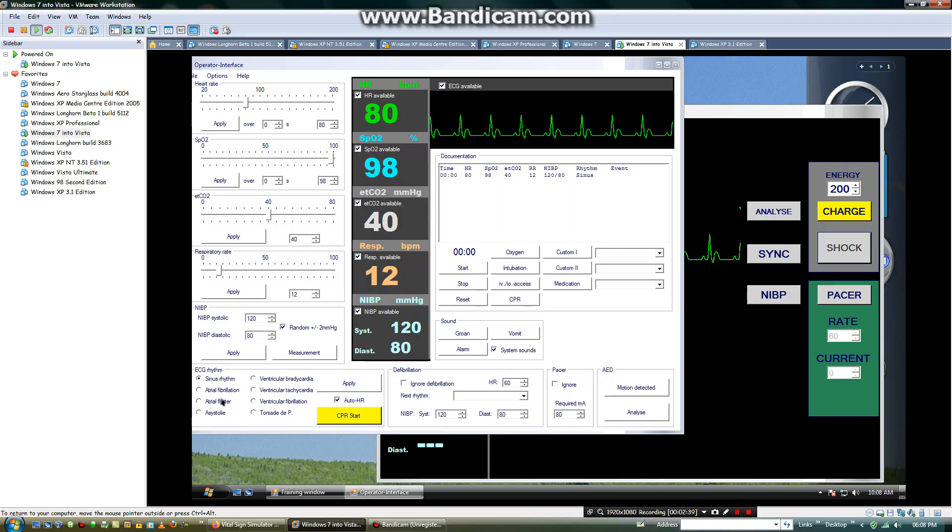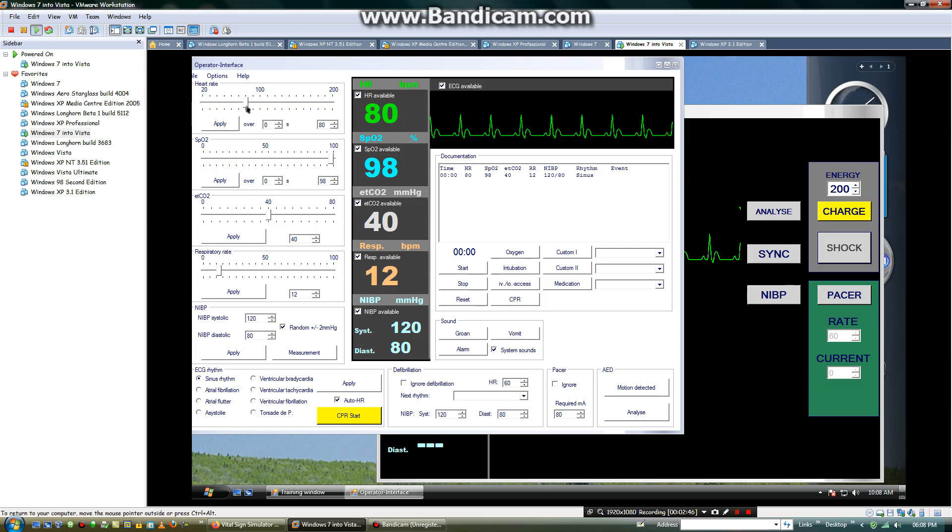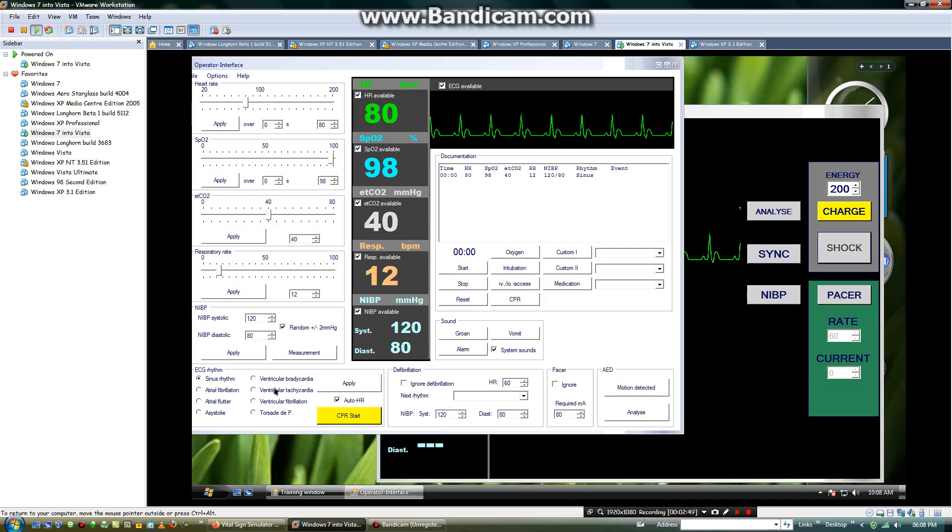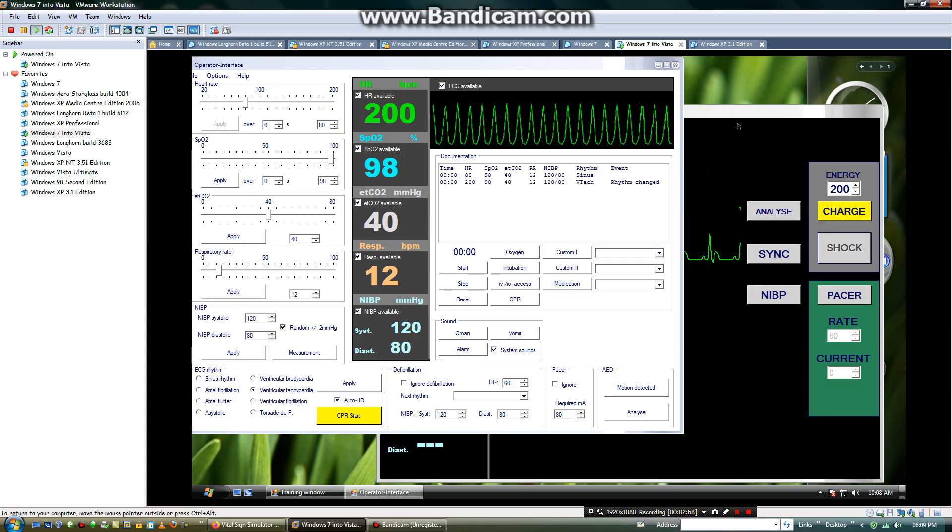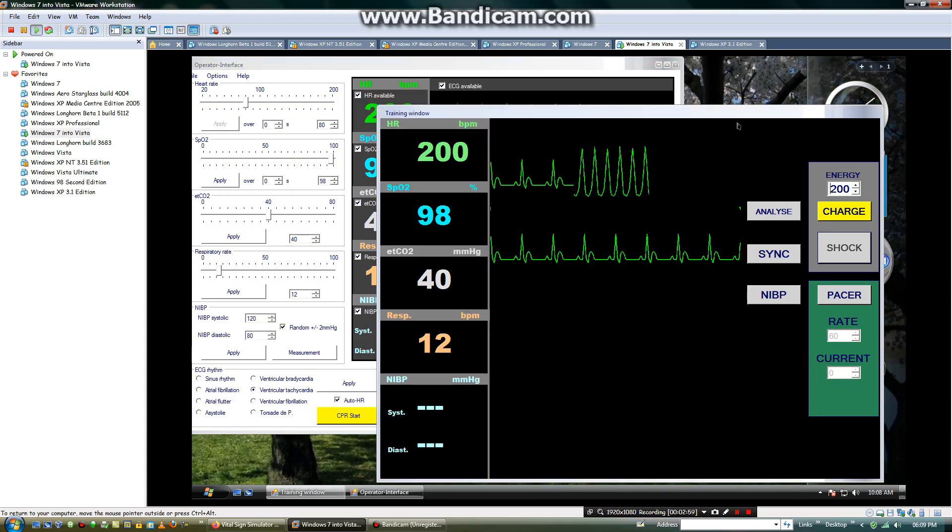Now I will choose. And the heart rate can also be changed. Then you will change. I would want to change the rhythm to ventricular tachycardia. And this rhythm will come up.